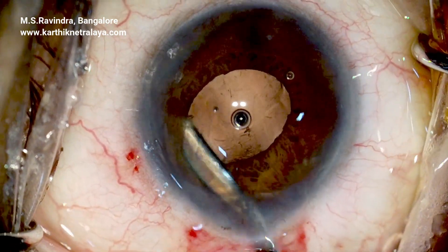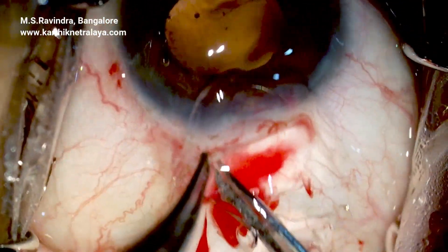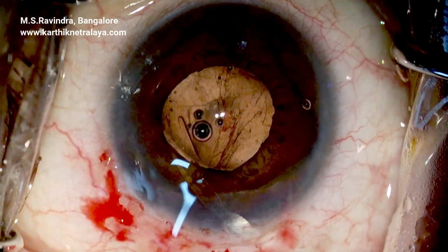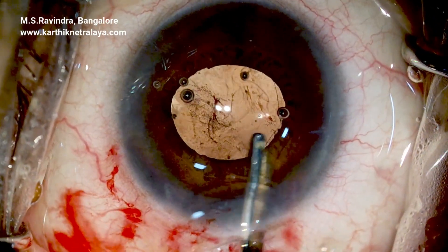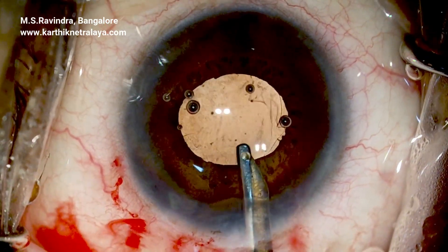The chamber is not deepened, and intraocular pressure is kept very low throughout the surgery to avoid pushing the capsular diaphragm backwards, which could extend the rhexis run-off. The lens is implanted in the capsular bag; the site where the reverse rhexis was started is intact and does not extend to the periphery.